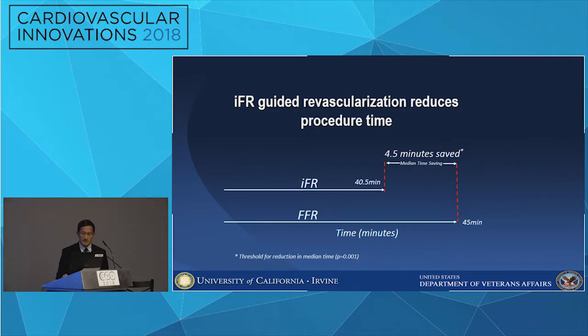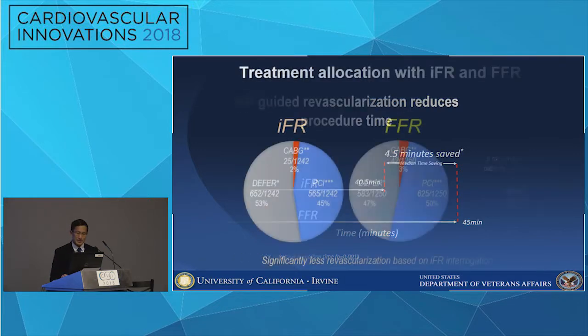can definitely attest to that. For many lesions you could quickly measure, and I actually measured a 3-vessel IFR just last week in about 5 minutes. So I was just quickly switching over using a common guide and was able to do so.